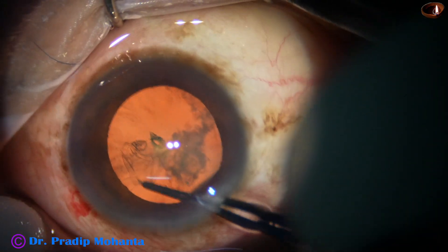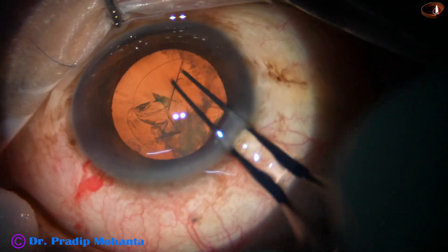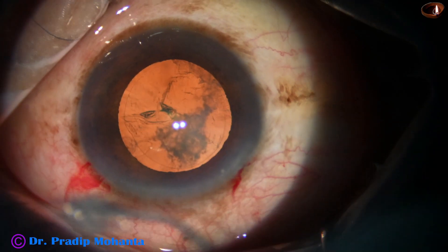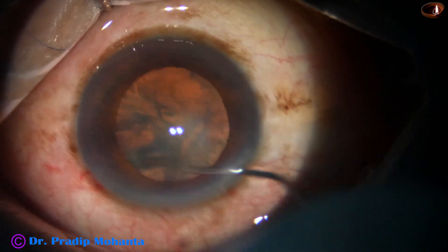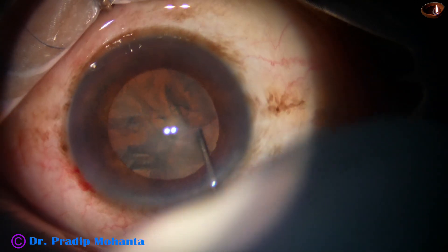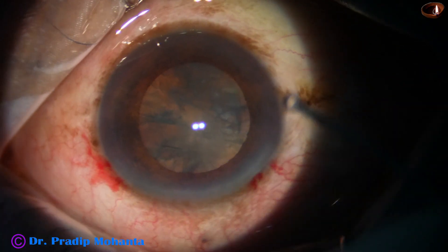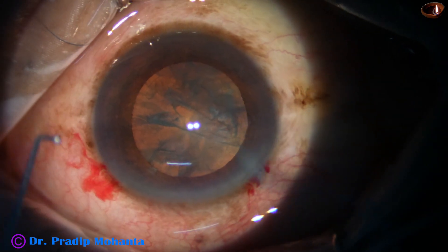We are using the stereo coaxial illumination of the Lumera T microscope and it has a beautiful red glow. Hydrodissection is done with BSS and a 27 gauge cannula.